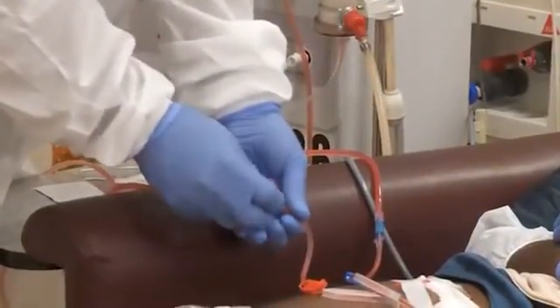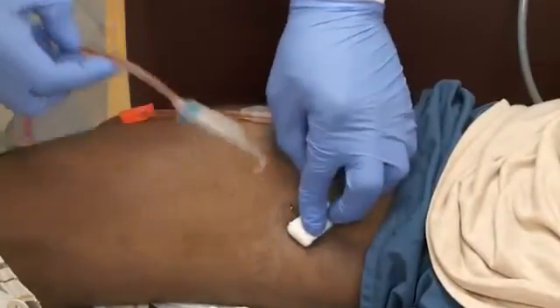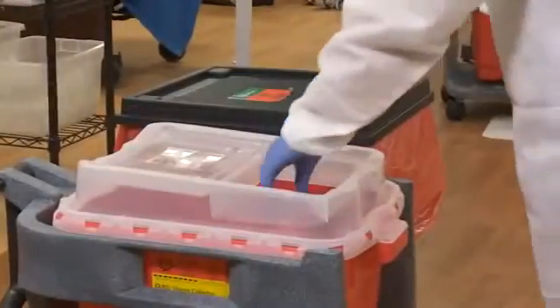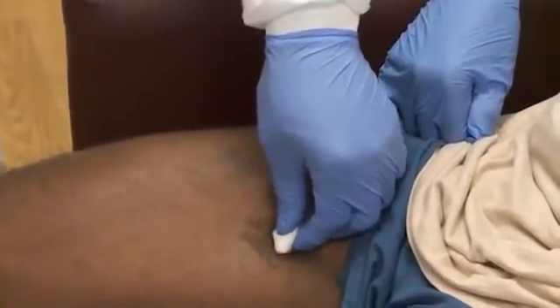Disconnect from the blood lines using aseptic technique. Activate the needle retraction device and remove needles using aseptic technique. Dispose of the needles in a proper sharps container. Apply clean gauze or a bandage to the access site and compress it with clean gloved hands. Both the staff and patient should remove gloves and perform hand hygiene. Following these steps will reduce the risk of an access-related infection.